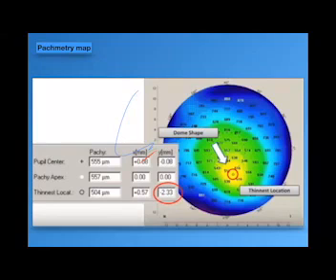like. It will overcome the opacity. It will pass through the opacity, but with less transmission. So it will be affected: the corneal surface, the corneal thickness, and the elevation maps. Topography, pachymetry, and maps will be affected. So in this patient you will get steep curvature, thin pachymetry, and false high elevation in the anterior and the posterior surface of the cornea.